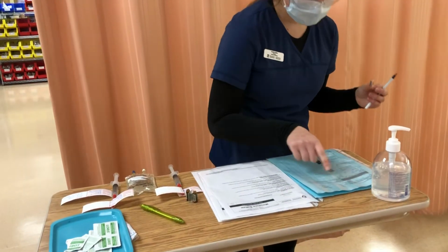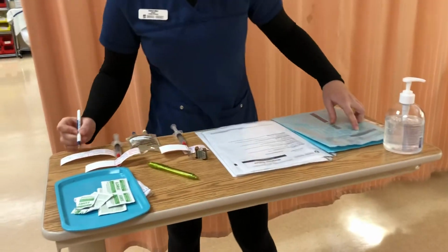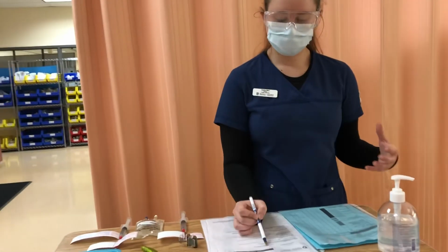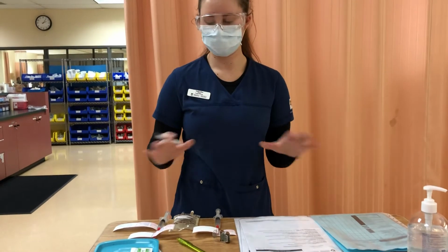These can be given IV. The PCA dose is 1 milligram, lockout interval of 5 minutes, final bag volume of 50 milliliters. And this is due now, so I'll be preparing to give it now, and this is the recipe for PCA. So that is all exactly how I want it, so I'm going to get a second nurse to come and verify that everything is correct.